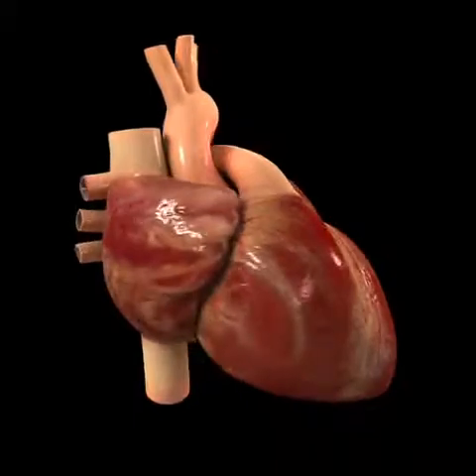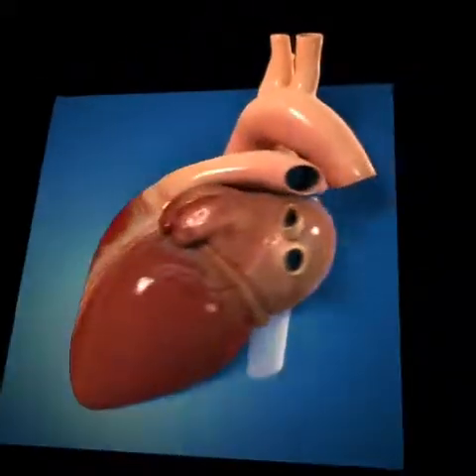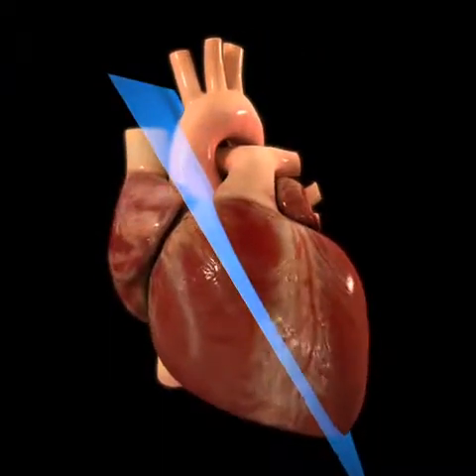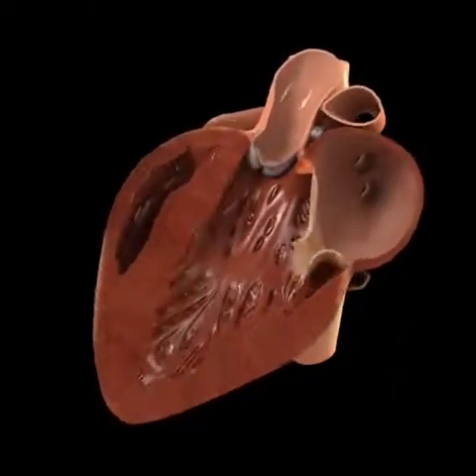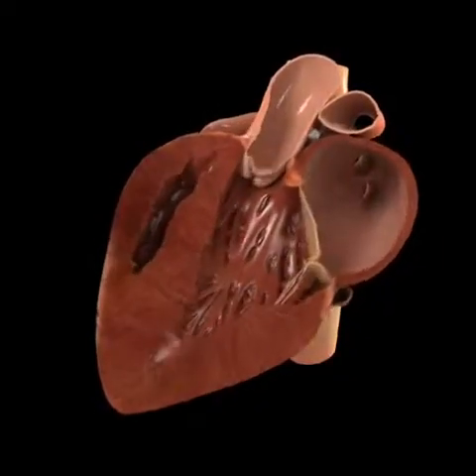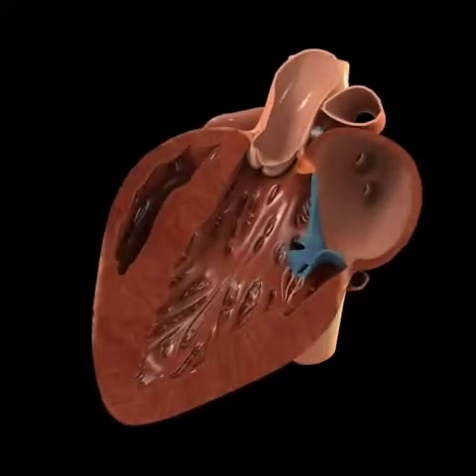The parasternal view is obtained by sectioning the heart in an anterolateral direction, starting from the base towards the apex. We can see the right coronary leaflet and the non-coronary leaflet of the aortic valve, as well as the ascending aorta. From the mitral valve we can see both the anterior and the posterior leaflet.